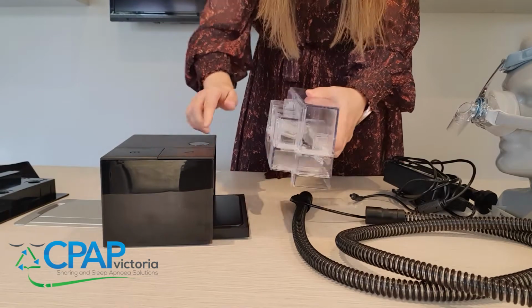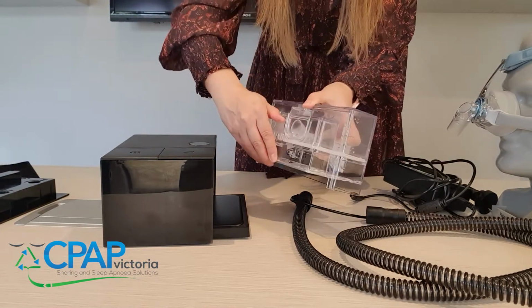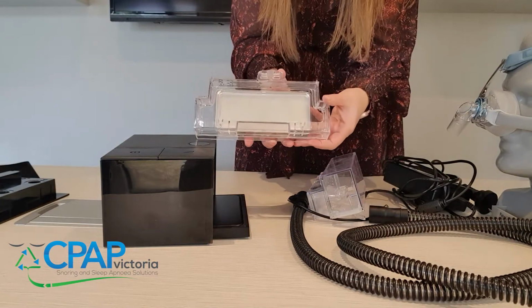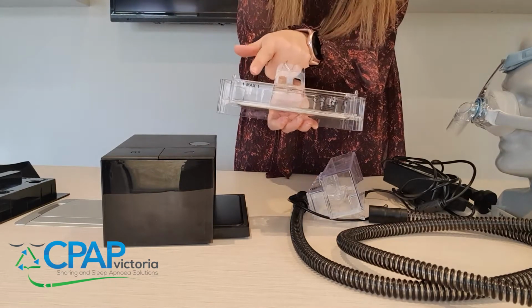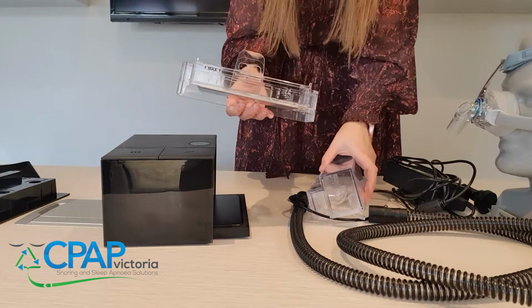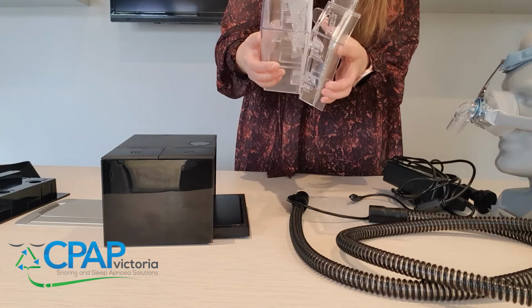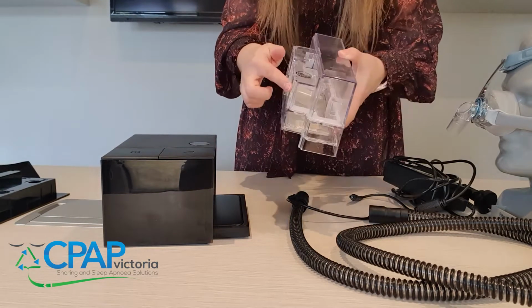To fill the chamber with water, it's just a matter of unclipping it and then taking note of the maximum water line and filling it up to just below that level, and then reconnecting the top and sliding it back into its position against the pump.